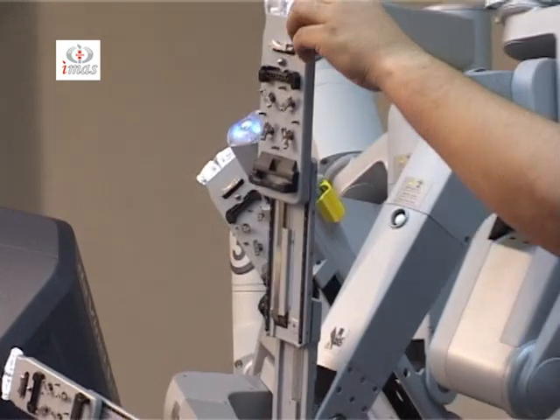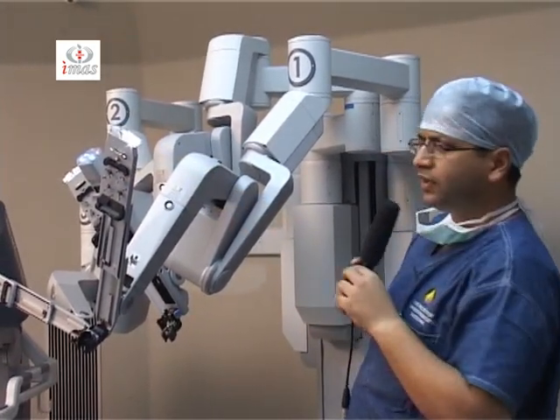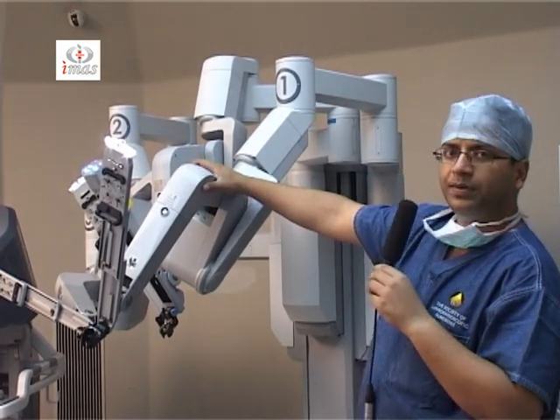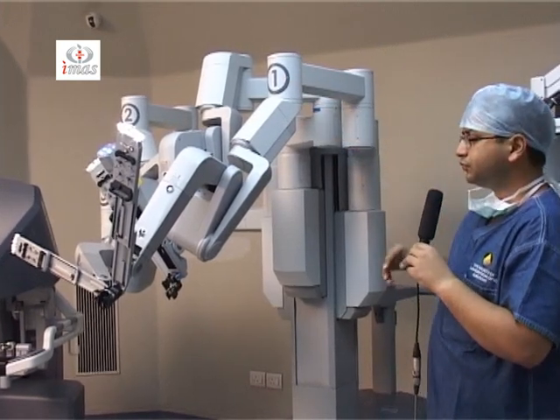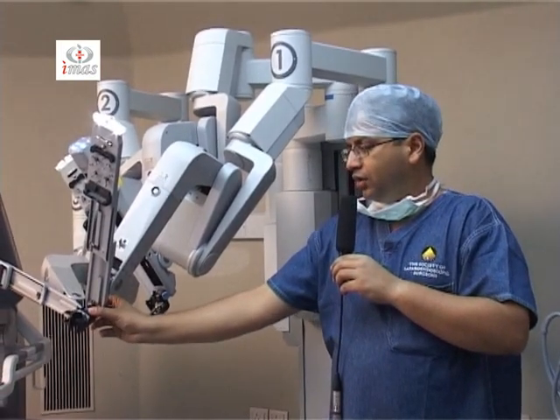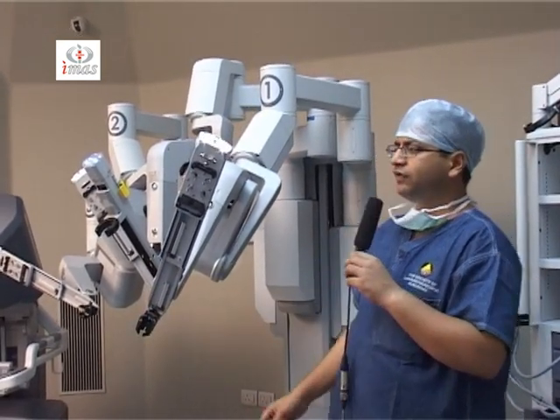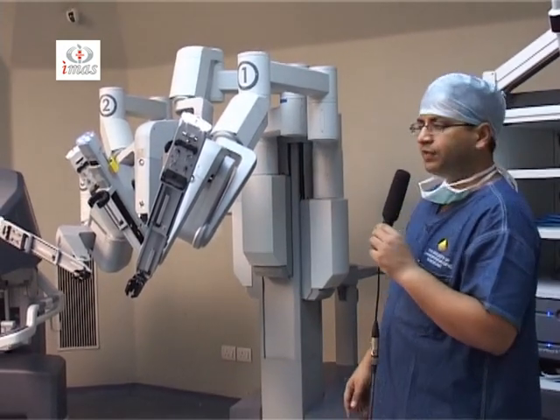So this leads to finer movement, and this leads to all the movements from the master controllers. The master controllers cannot move the proximal aspect of the arm. They can move just this silver part of the arm, not the proximal aspect of the arm. This port clutch button is given at the back end of the arm also, in order to facilitate easy pressing while docking. Docking is the process of application of these instrument arms to the ports placed on the patient's body.